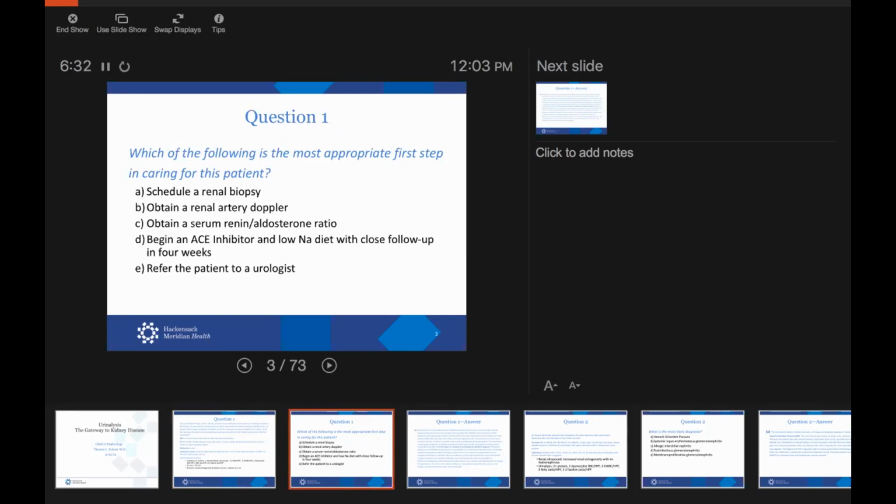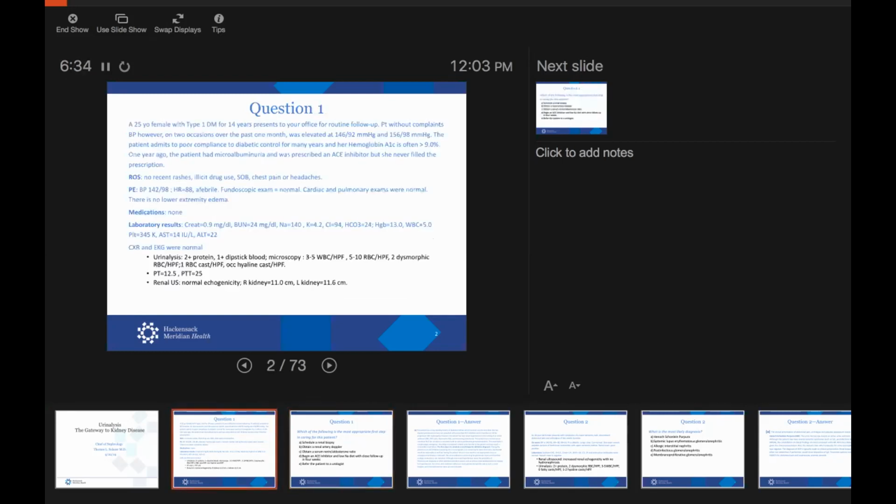So this is what you missed, okay? These dysmorphic red cells represent a red cell cast. I want to raise a question here for those who have been working across the continuum of hospitals anywhere, in New York, wherever you come from. Does anybody see red blood cell casts reported on the urinalysis test? Anybody here?